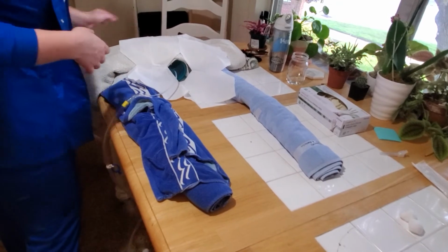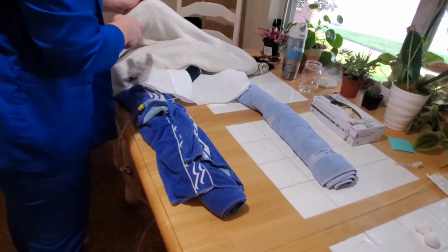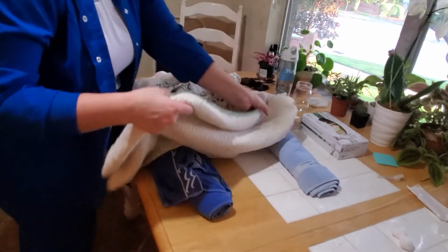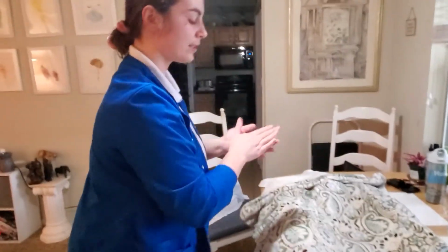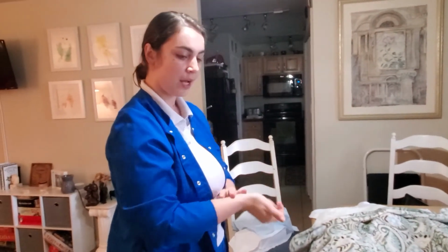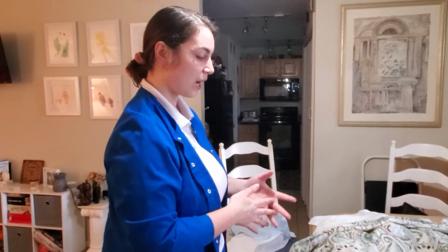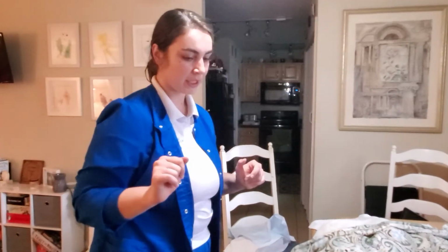All right, Anna, you did a great job. Do you feel any discomfort or pain at all? No? Okay, so I'm just gonna lay your blanket down. Perfect, you did great. All right, so now I'm going to just go and document what I saw when I got the urine to come out. I will be documenting the amount of urine that came out, the color, the clarity, and the size of the catheter that I just inserted.